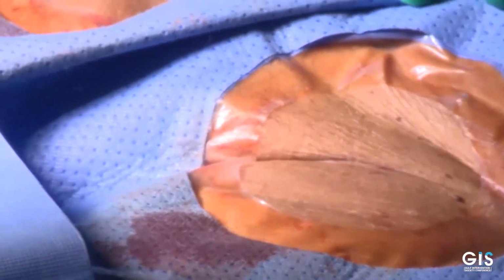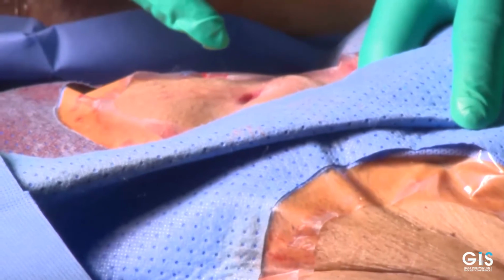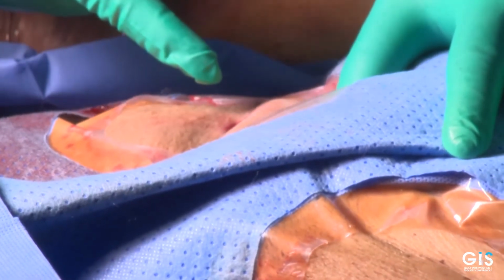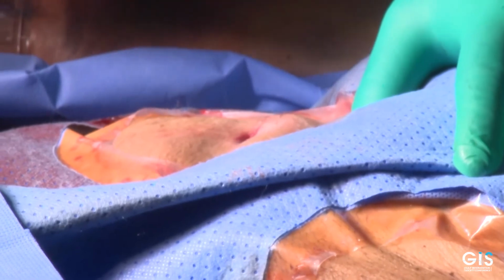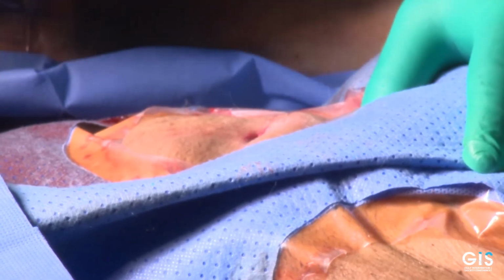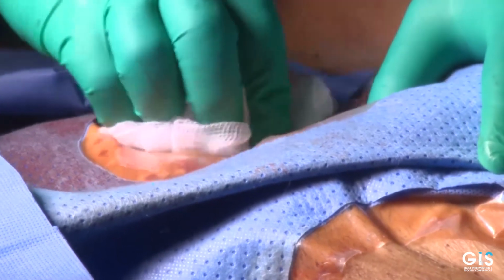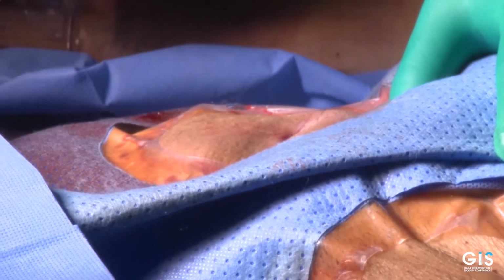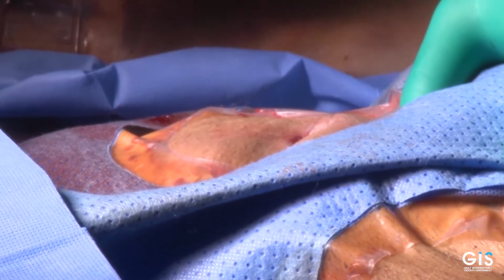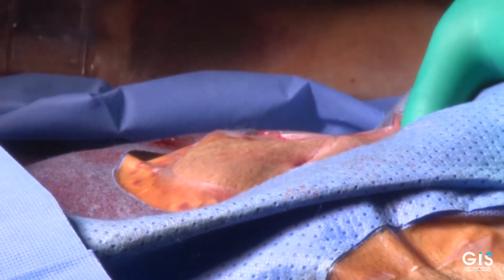This is the site that I want to show you the most. This is how big the entry point or the skin cut that we use is. This is less than 1 centimeter. As you can see here, this is what we use to access the femoral artery for our TAVI procedure. So this is closed with 1 ProGlide. After that, we checked that it was intact and there was no stenosis. And we gave protamine, and you can see what it looks like with only 1 ProGlide.